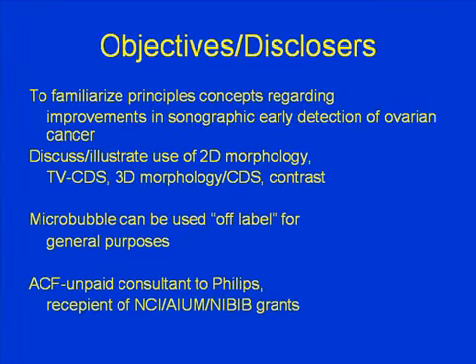Microbubbles can be used off-label for general purposes in this country, but are not FDA approved at this point in time. We hope this will be changed in the very near future and have microbubble technology available for general applications.